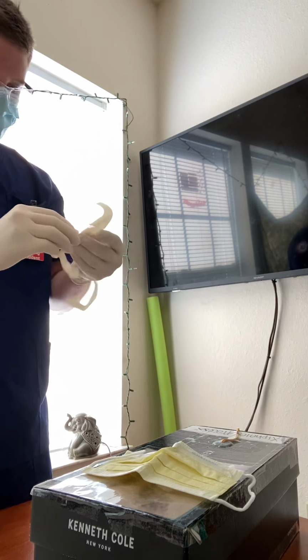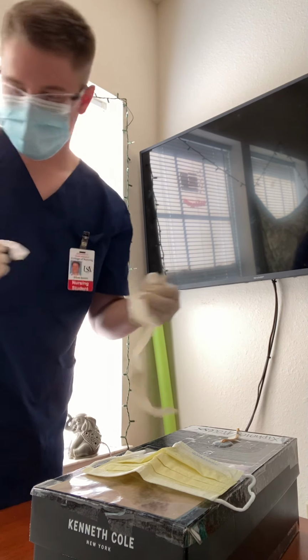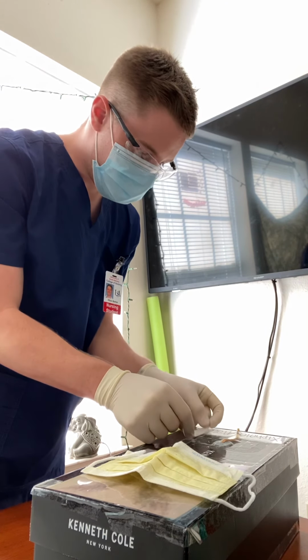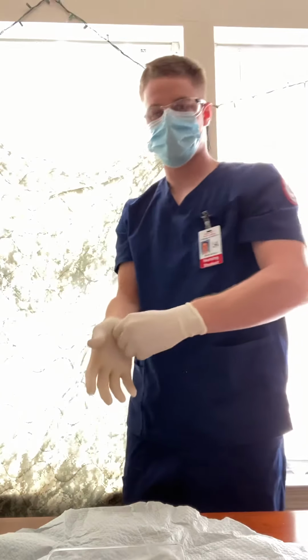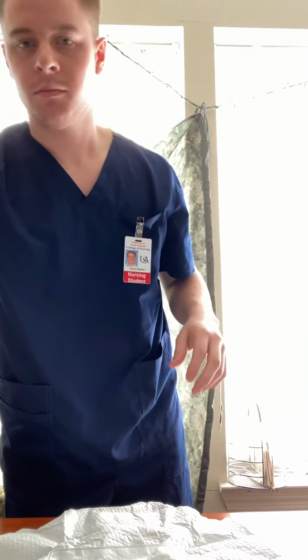And then I'm going to keep this part of the tegaderm right here, this label. And then I would place it on the dressing and write the date, time, and my initials for the dressing change right here. And then after I've done that, I'm going to move the camera again. I'm going to dispose of my gloves downwards towards the trash can, removing my goggles as well as my mask, and also removing the mask of the patient. After I've done this, I'm going to raise the side rail of the patient.